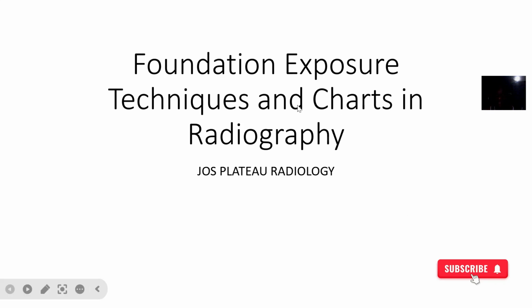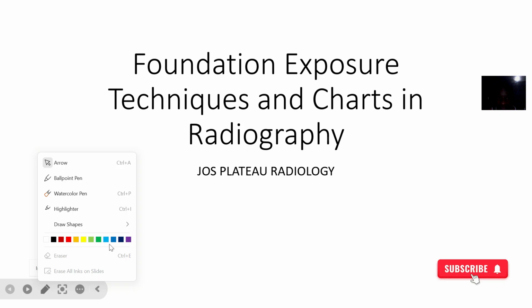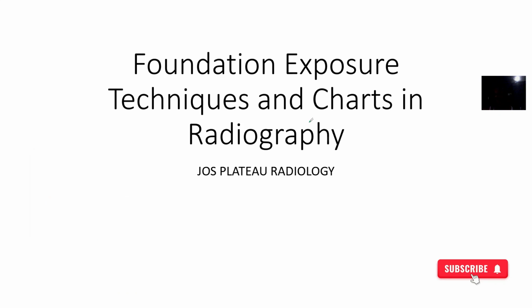Now we'll quickly look at the aspects of foundation exposure techniques, and also the charts. This is what actually helps radiographers to say that, okay, for this particular patient, this is the amount of exposure the patient will need. Do you understand? They help in decision taking.